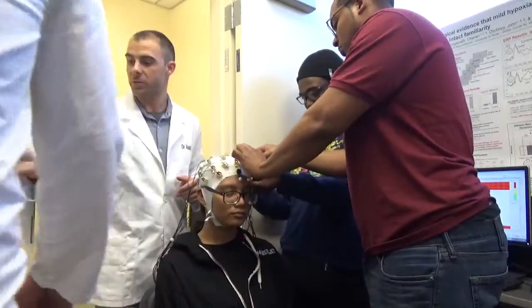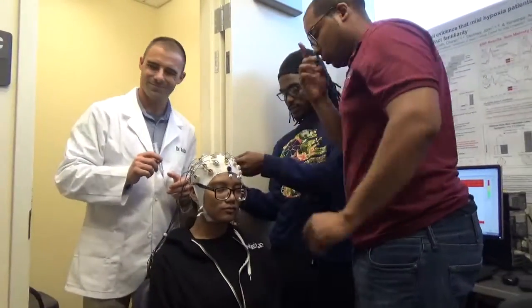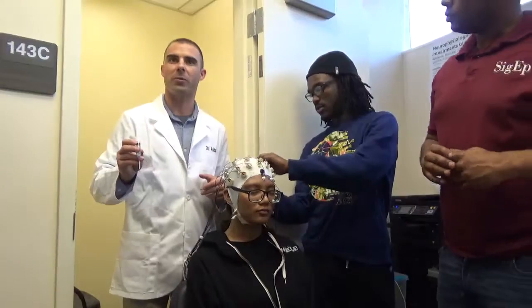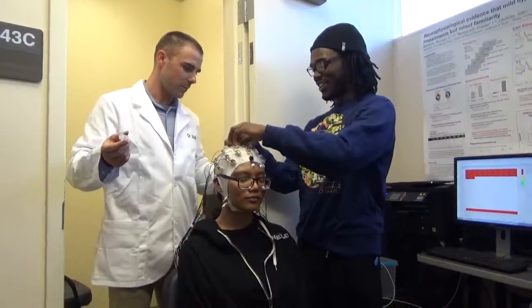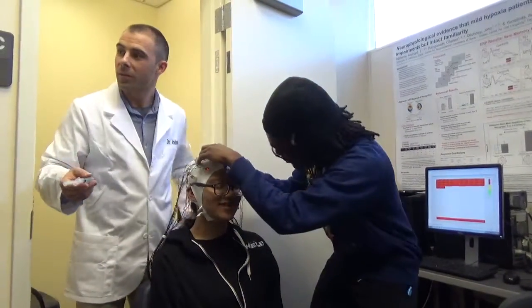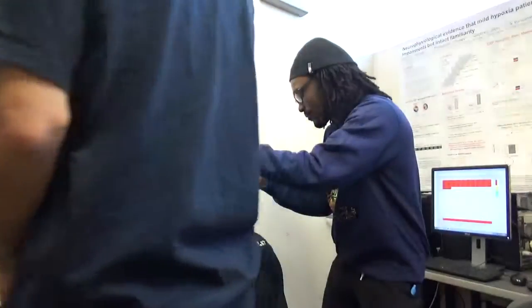Okay, so we're gonna need these syringes. Okay, so some people who haven't been up here yet, let's rotate through. I need some people to grab some of these syringes. It's the tedious part. Back there. You guys wanna? I don't bite. You guys are gonna have to do this for data collection sessions anyway, so we might as well learn. Grab one of those. Somebody else?